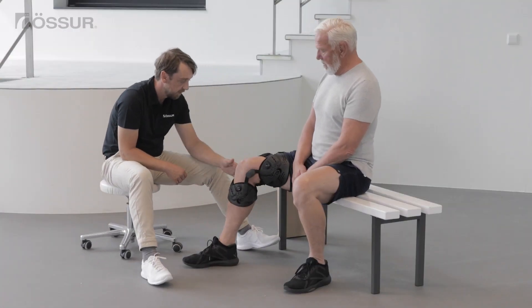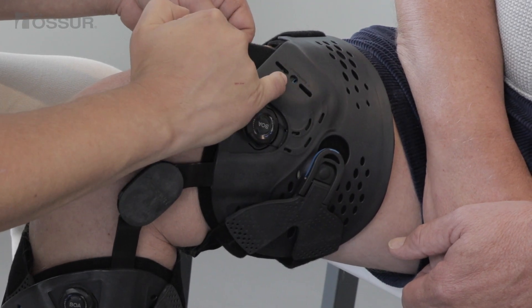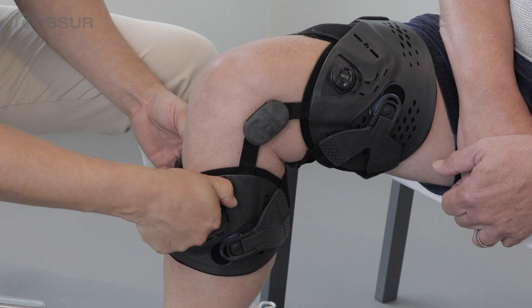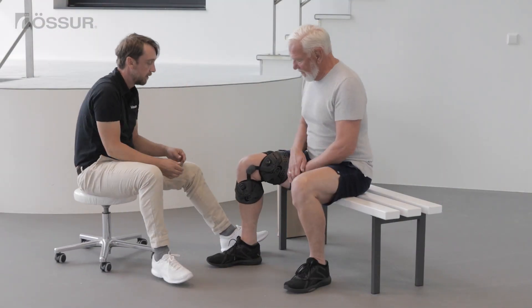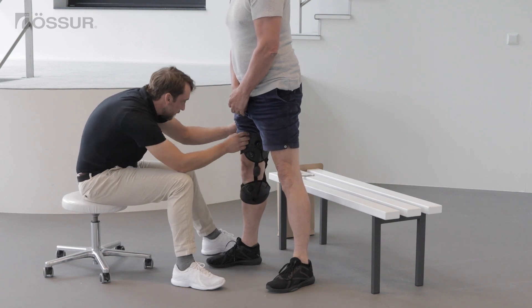Bend the knee. Turn both upper and lower smart dosing dials clockwise until the blue indicators are in the middle position. Ask the user to stand up and verify the correct positioning of the brace.